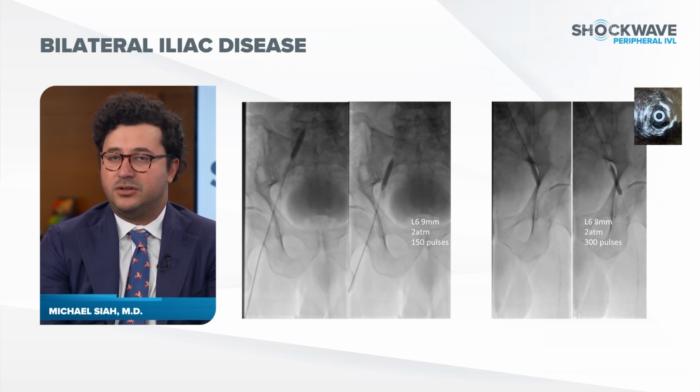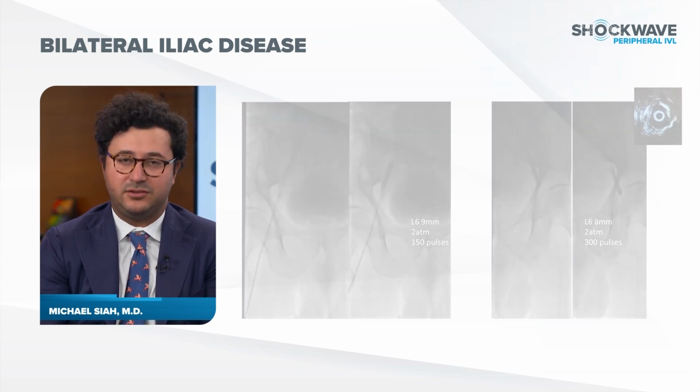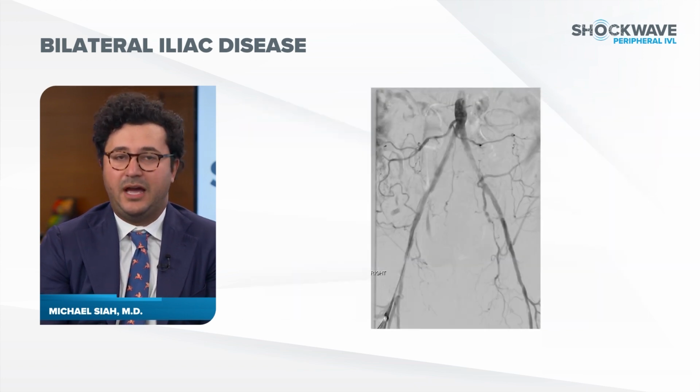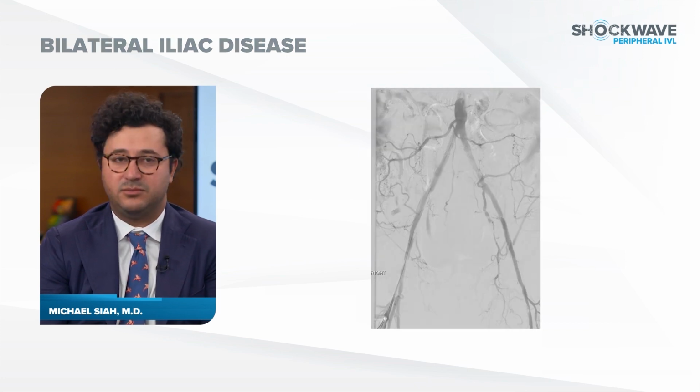And you can see that circumferential 360 degrees calcific burden of that left external iliac lesion, and ultimately ended up placing 2 self-expanding stents, and excellent result. More importantly, the patient's symptoms resolved, and he's doing really well at follow-up at 6 months.